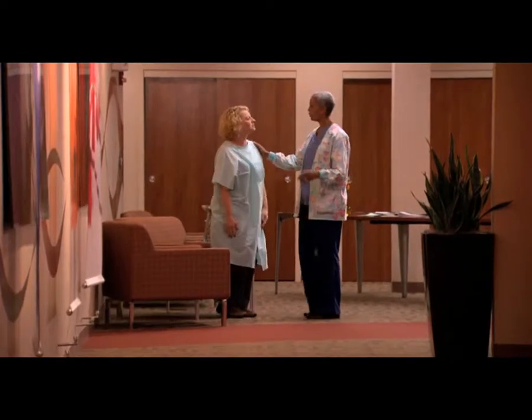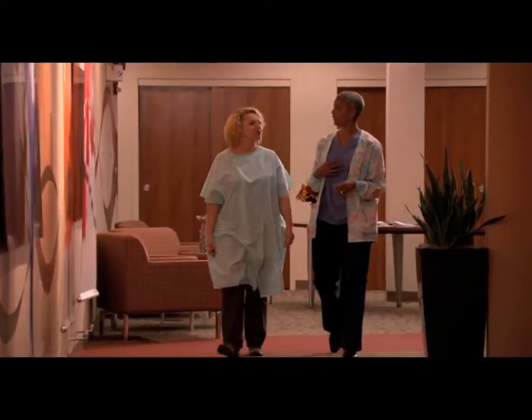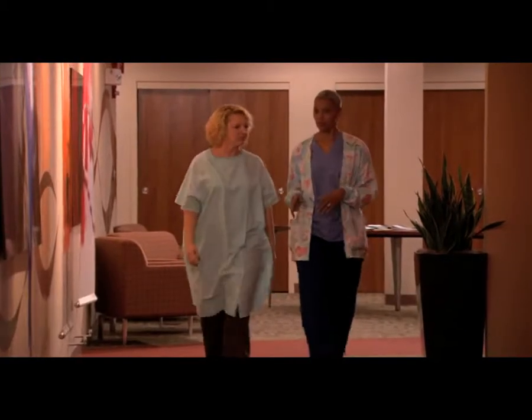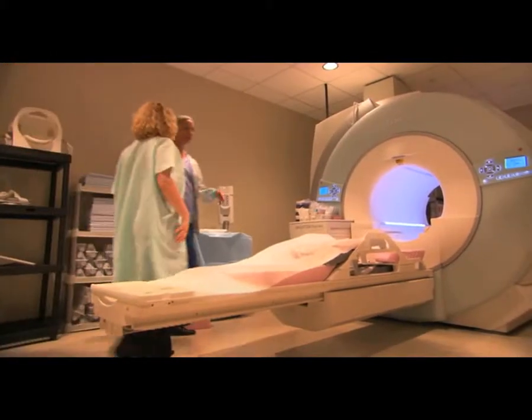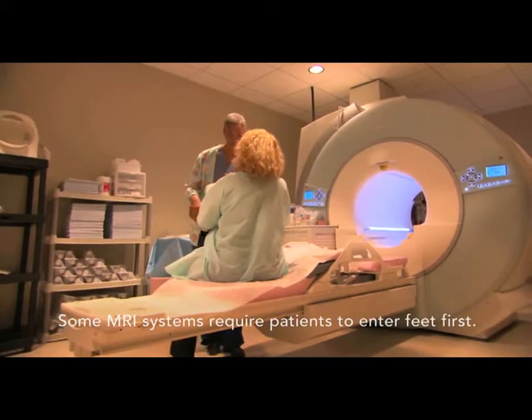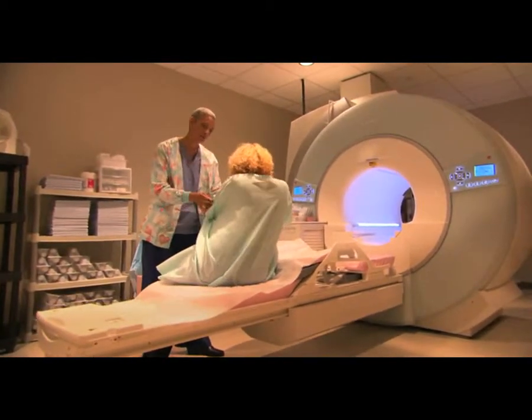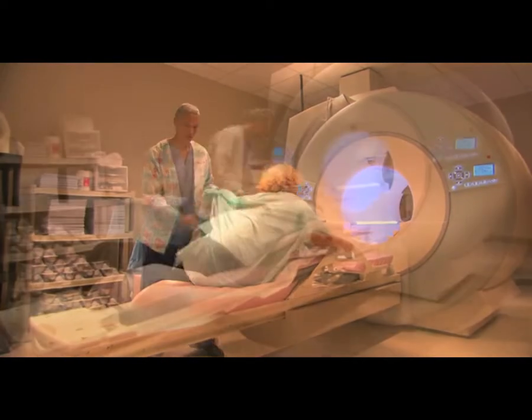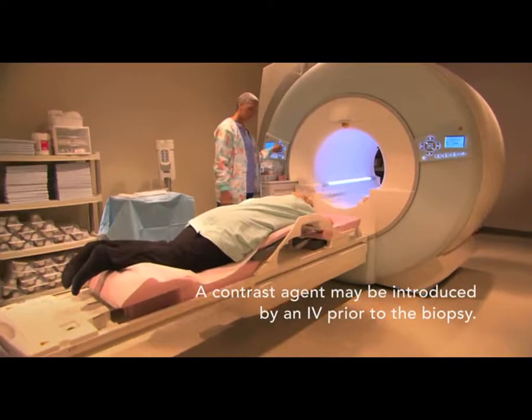Of course, it's okay to be nervous about any medical procedure. But it's really not quite as scary as it sounds, and it helps to know ahead of time what's going to happen. Your biopsy will take place in an MRI suite. You'll be lying down on a special table while the team takes images and performs your biopsy. Normally, you'll move in and out of the magnet about three or four times during the procedure.